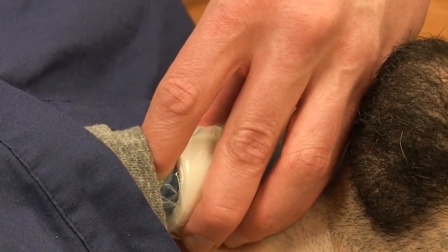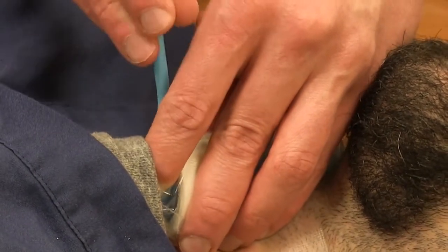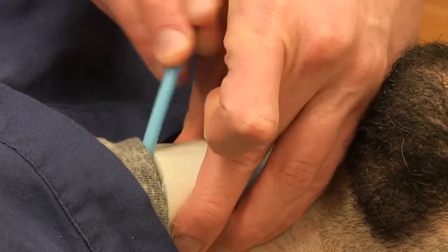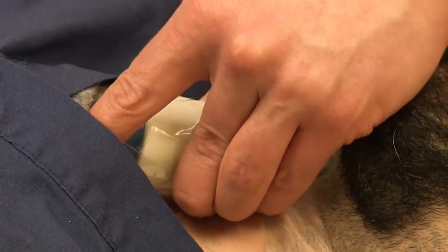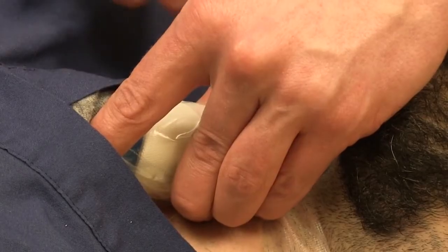All the way in until I can touch the back of the cricoid. At this point I grab my bougie, run it along my finger, and feel it enter the same space as my finger. Only at that point does my finger come out. The bougie is then advanced until I know it's past the sternal notch — so at least this much of bougie has gone in.